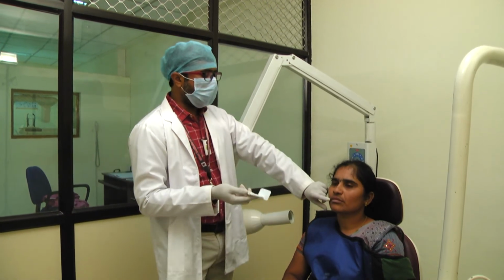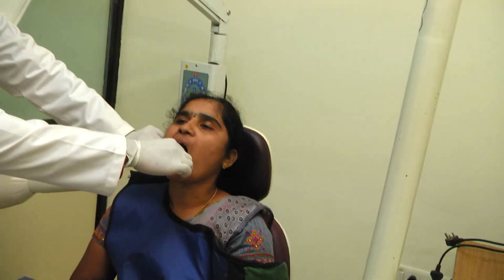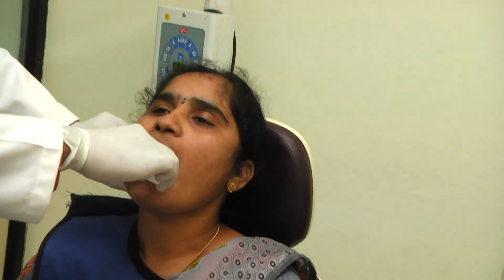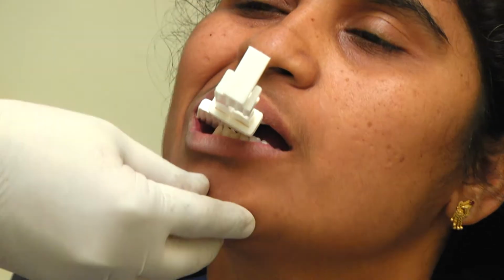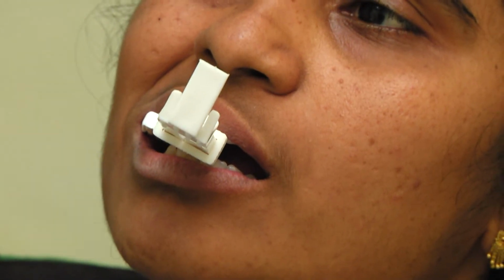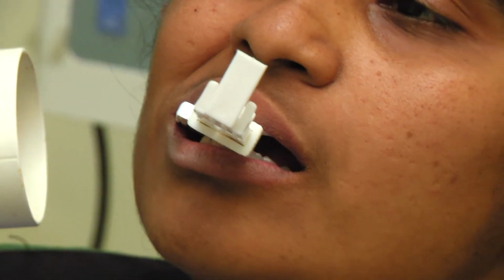While taking for premolars, make sure that both the premolars exactly coincide in the center of the film, and once it is placed, ask the patient to bite and then adjust the vertical angulation. For the mandibular premolar it is minus 10.